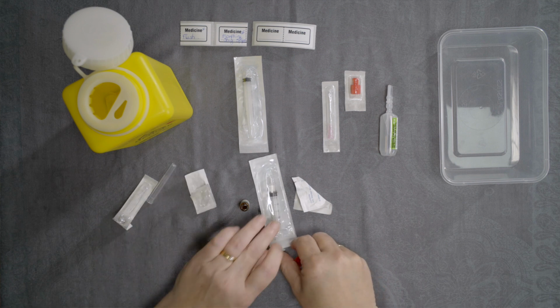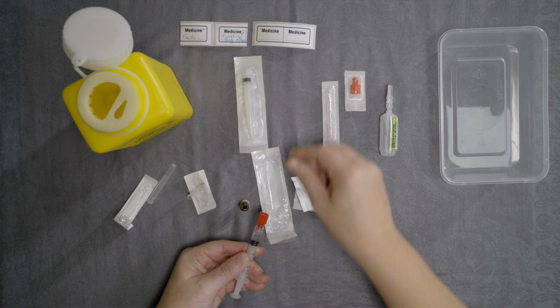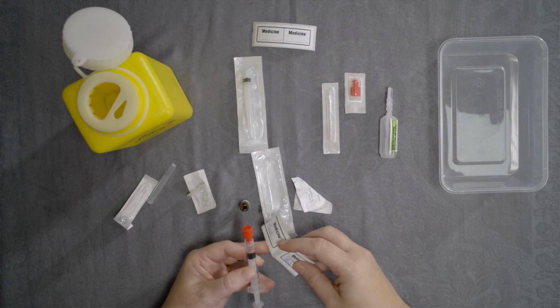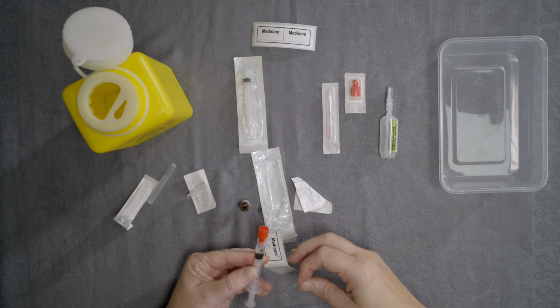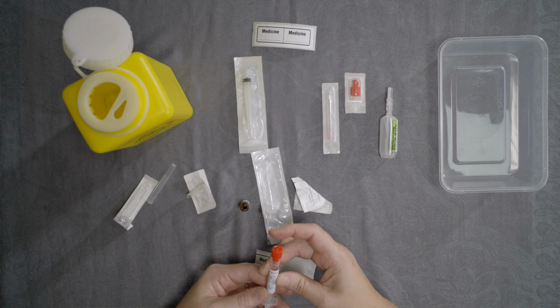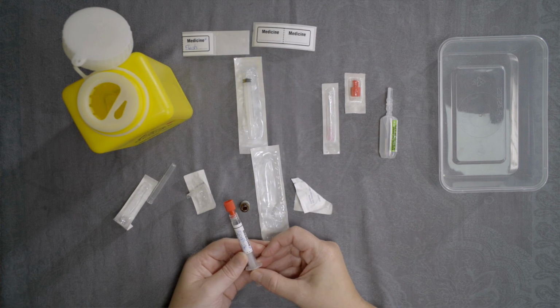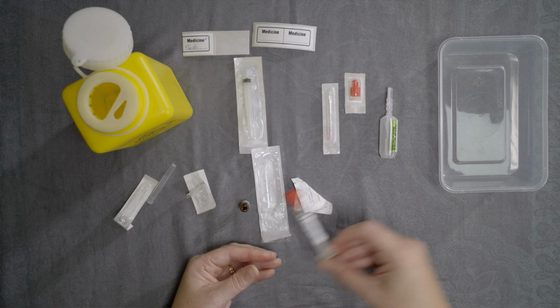Syringes must be labelled with a date, medication and dose and stored for later use. It is very important that you label the syringe straight away. Your palliative care service will provide you with the appropriate labels that are used and the information about storage.